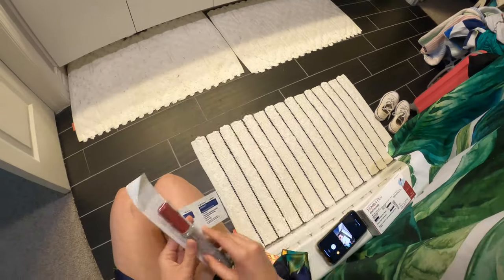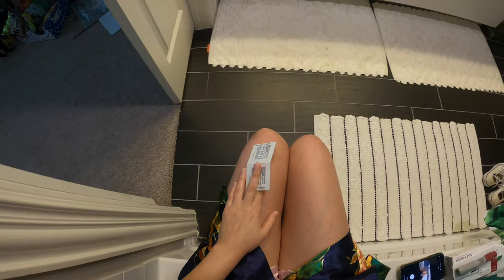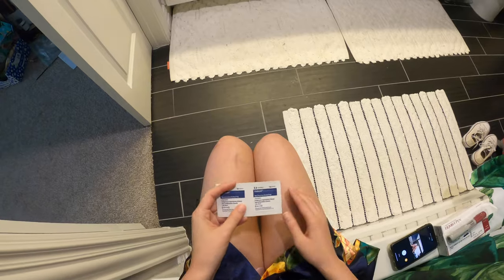So prepping for an injection — the first thing you do is you choose where you want to inject it: either your leg or your belly. I injected on my left leg last time, so I'm going to do my right leg.